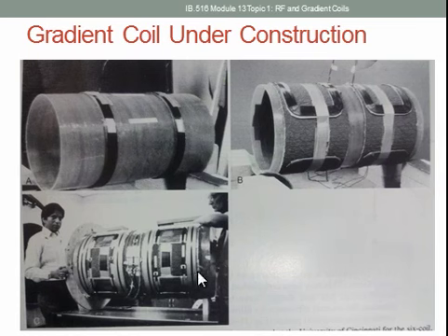This next image shows, I don't really know what all this stuff is in here, but again, I just wanted to show you some of the internals. So here, again, the Z coils, and I believe this is the Y gradient coil set. All of these coils I'm pointing at right now, hopefully you can see my cursor, all the coils here make the Y gradient. These two coils together make the Z gradient, and maybe in here is the X gradient coils.